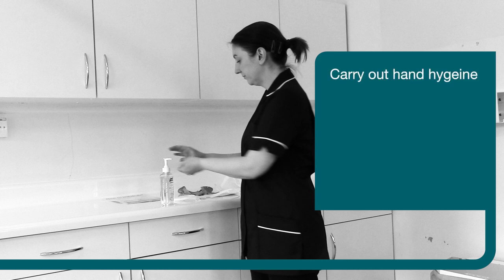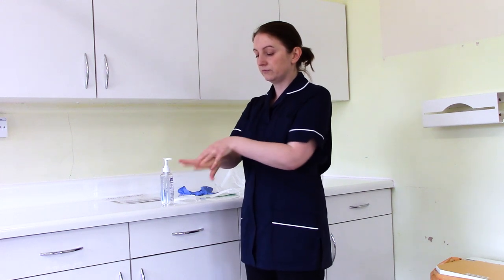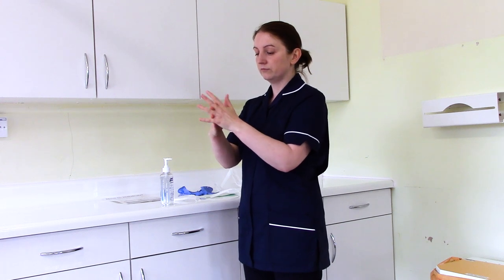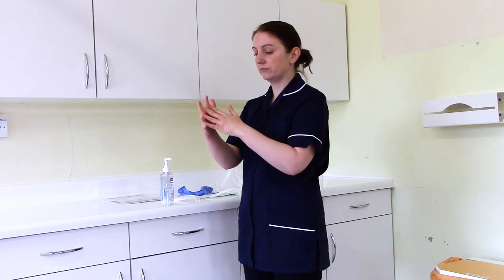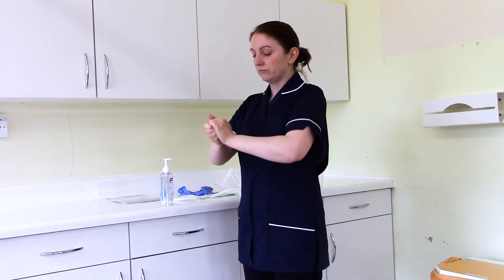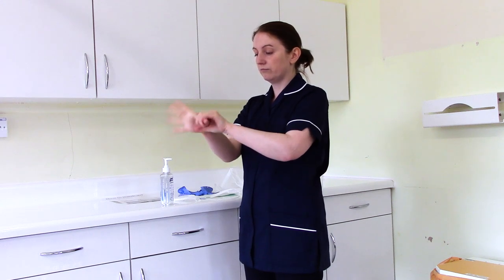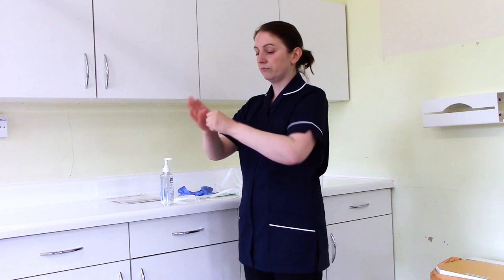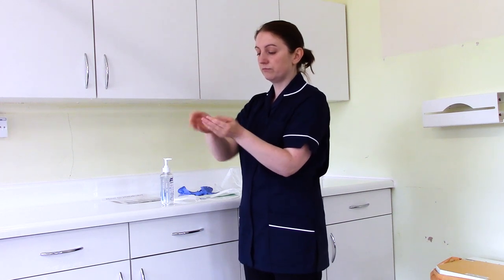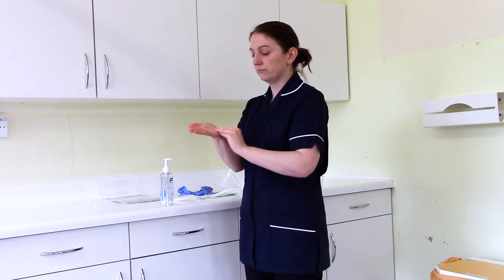First of all, carry out hand hygiene. Alcohol-based hand rub can be used if hands are visibly clean, if you have not come into contact with or potentially come into contact with body fluids, or you have not had contact with anybody with a potential or confirmed gastrointestinal infection. Ensure that long hair is tied back and is not touching clothing. Remove jewellery and lanyards, and ensure that any skin lesions such as cuts or abrasions are covered with a waterproof dressing.